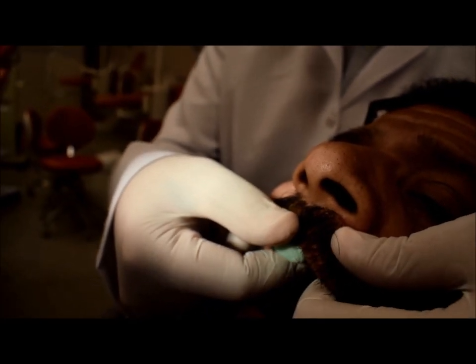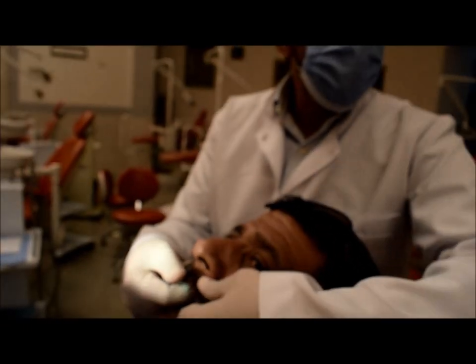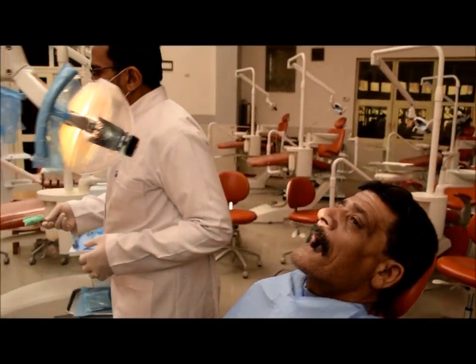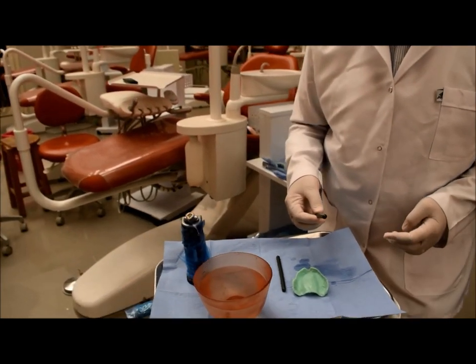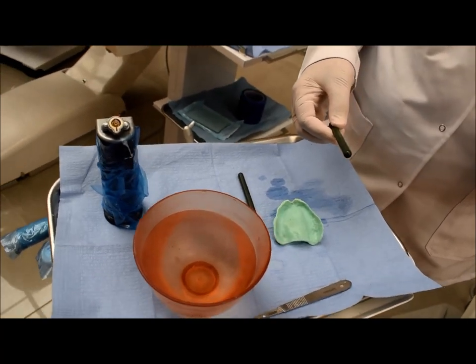If it is overextended, the green stick compound or the impression material will fall from the tray and the border of the tray will show. We will start by using the green stick compound material to trace the borders, then I will take the final impression and fine details using rubber-based impression material.